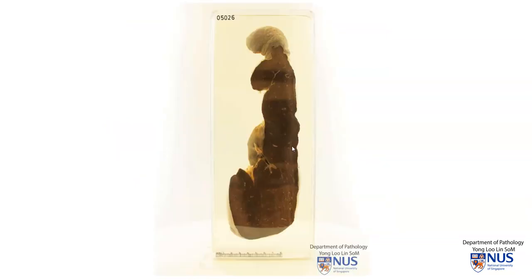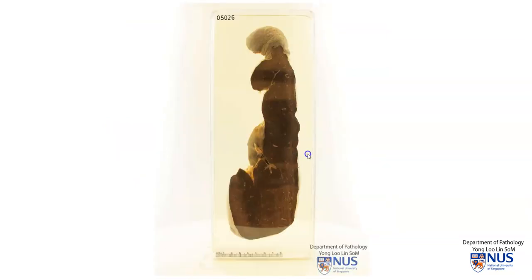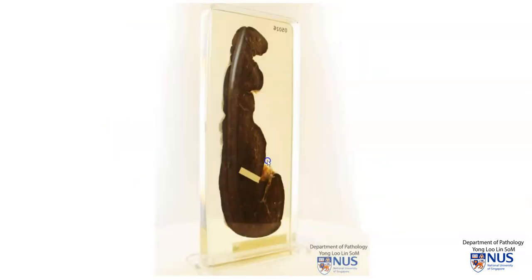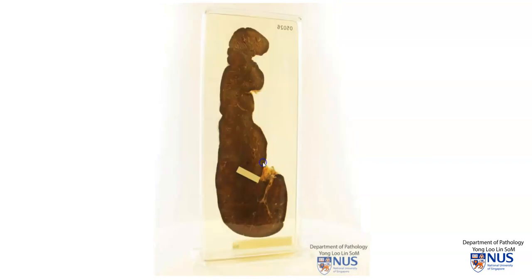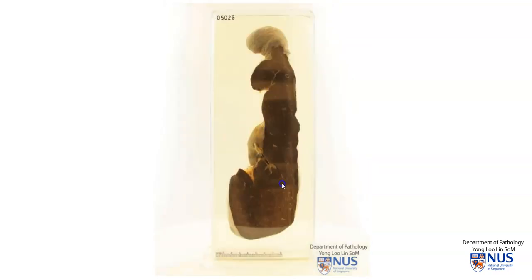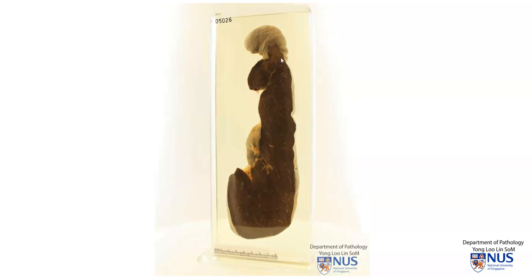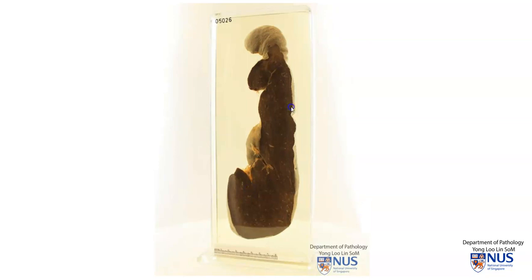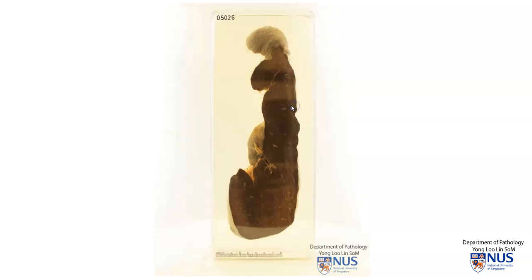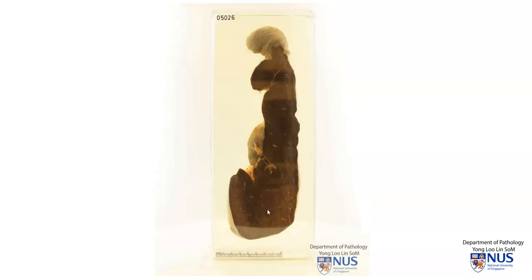So in summary, we are looking at a markedly enlarged spleen — this is splenomegaly. There are no localized or discrete lesions. And this is an example of congestive splenomegaly.